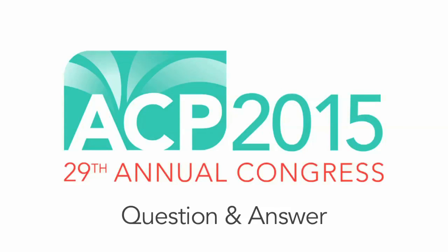I have a question about when you do the contrast-enhanced MR lymphangiogram, how long does it take? And for the kids, they're under anesthesia? Yeah, absolutely. And how long does it take? Probably half an hour, 40 minutes. Adults we do without anesthesia, local, because we continue to do adults at CHOP, because we use this fancy system, and as a pediatric hospital, they limit us up to 24 years old to give sedation or anesthesia.